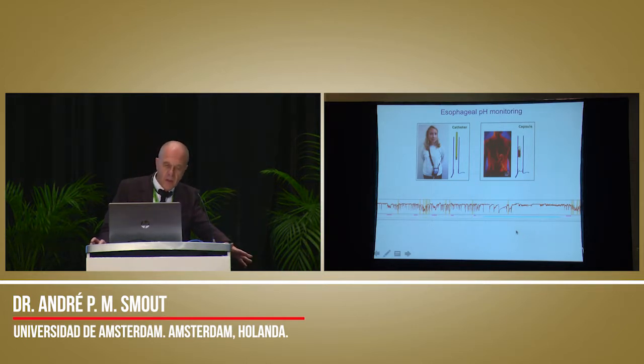Then it shows here pH-only monitoring, and that is basically what we don't do anymore. In our hospital, it's usually always combined pH and impedance monitoring.